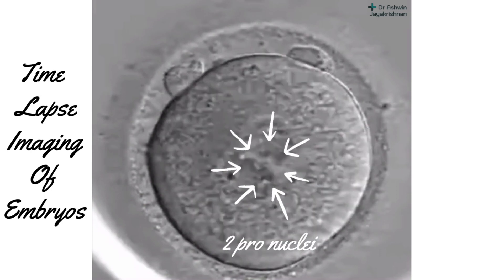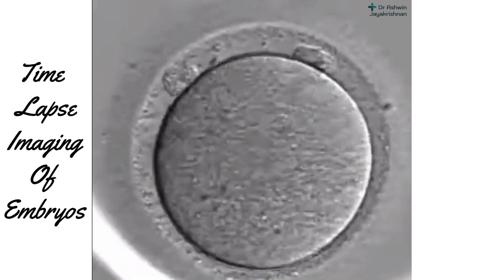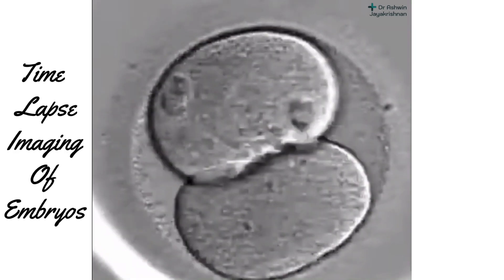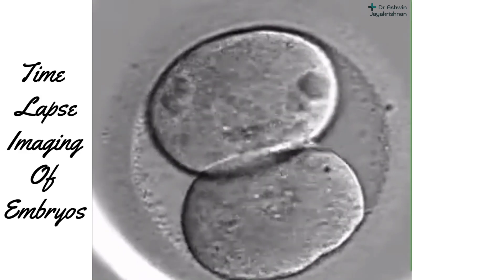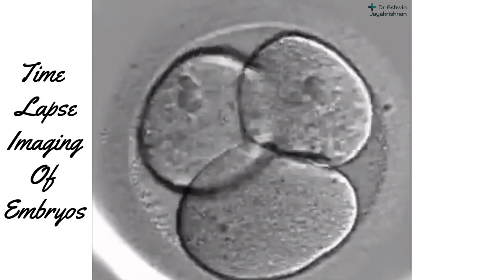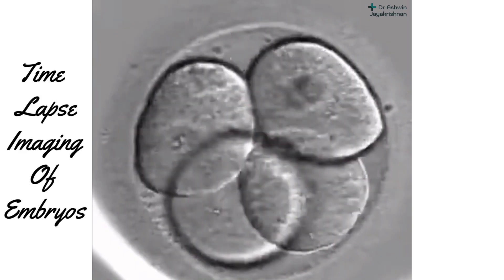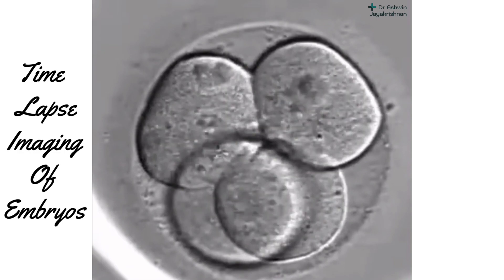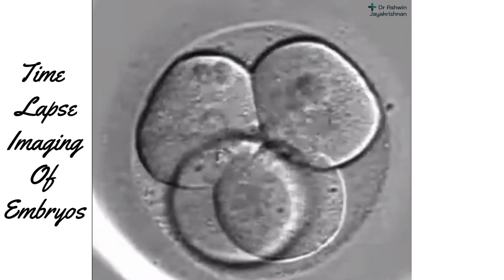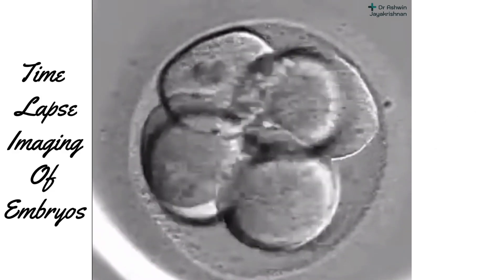First we will see the fertilization happening, which is identified by the presence of two pronuclei. Furthermore, around the second day there is division of the embryo to the four-cell stage. Subsequently the embryo growth continues and around the third day it proceeds to the eight-cell stage.